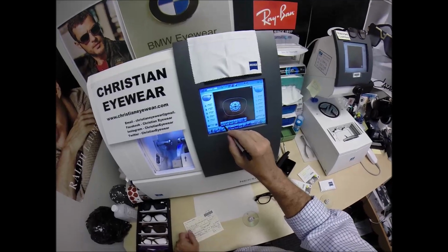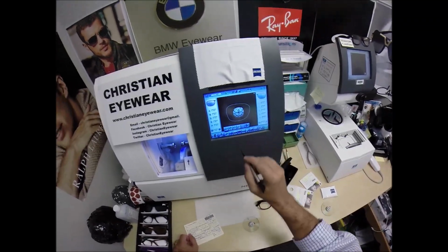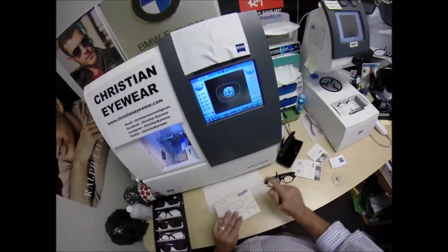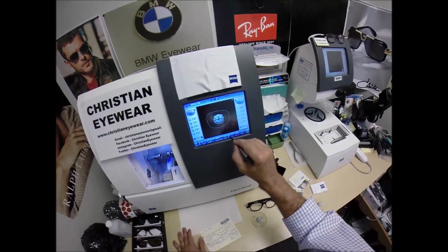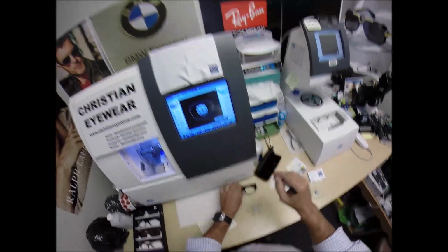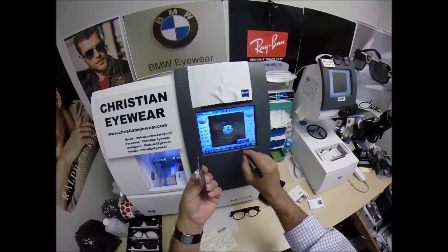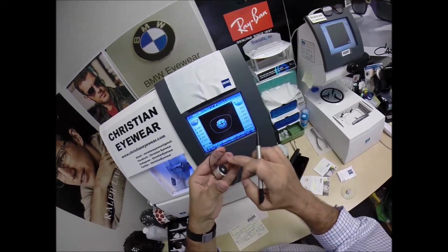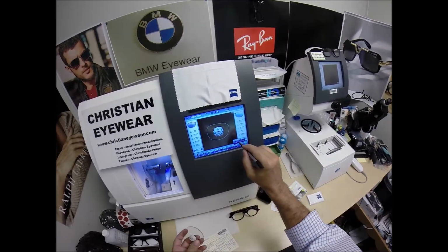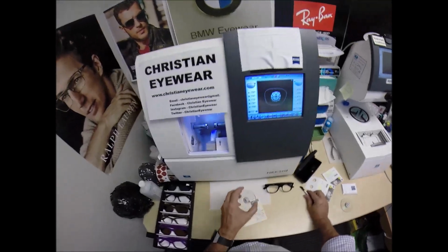These are polycarbonate lenses. If they were plastic, high index plastic or Trivex, I would select those materials, but we're going to stay with polycarbonate because that's the material of choice for me, but you can always get any material that you choose. I'm not going to polish the edge of the lens because it's not going to be seen in this frame. I'm not going to put a safety bevel on the front convex surface of the lens because it's not going to protrude from the frame. I am, however, going to put a safety bevel, which is a very fine grit sandpaper, on the back concave surface of the lens. Even though no portion of this lens will protrude from the frame, you'll see why I do that in just a moment.